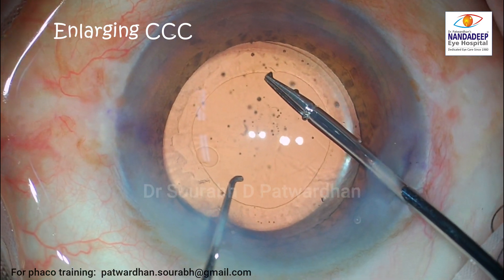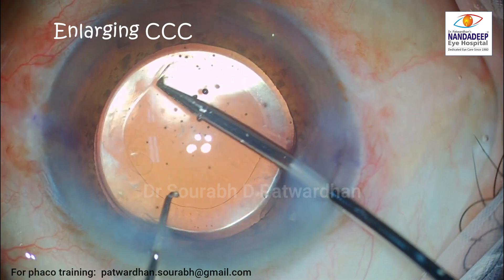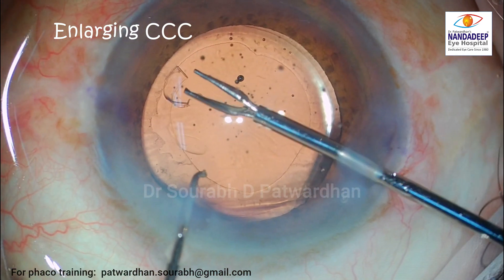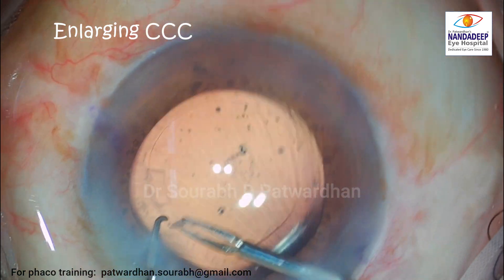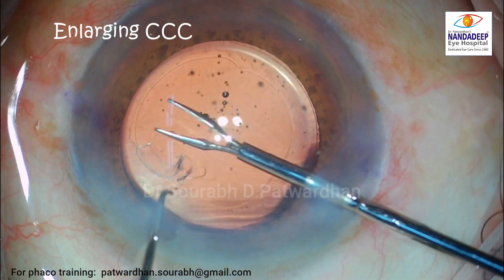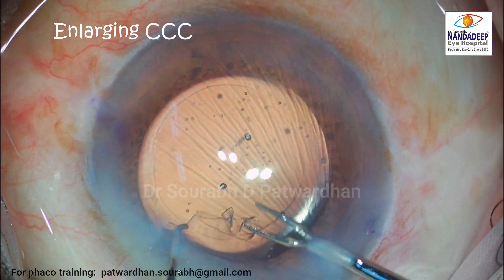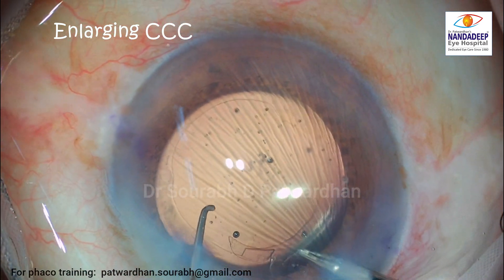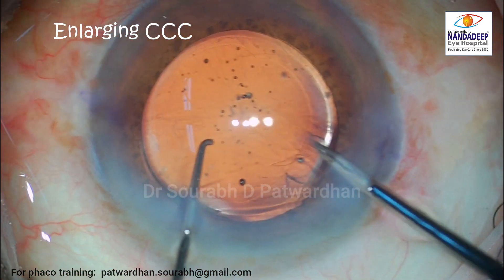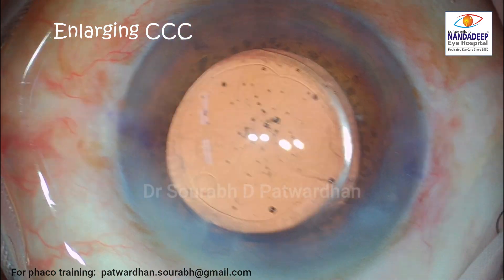I use my favorite microcapsulorhexis forceps and, using the IOL optic as a template, I am grasping and re-grasping the torn edge of the capsulorhexis, enlarging the CCC to the desired size. Take your time, keep the anterior chamber well inflated during this maneuver, and achieve a nice larger CCC which will avoid the chances of phimosis and in turn prevent IOL decentration.